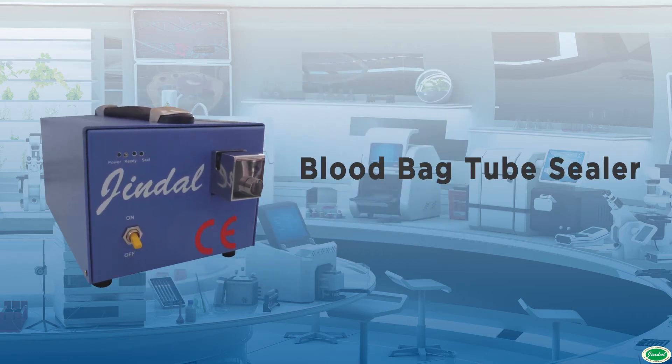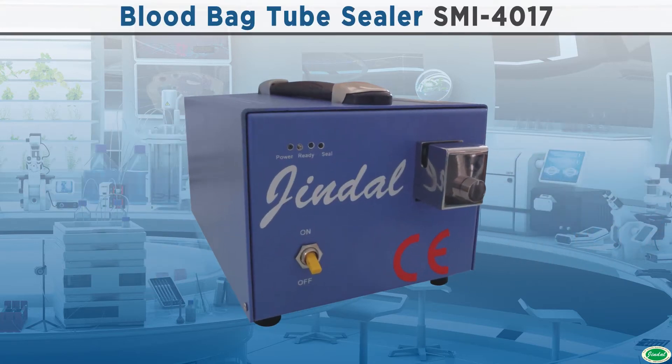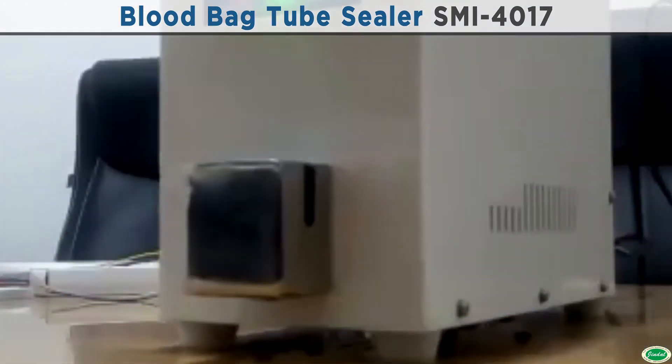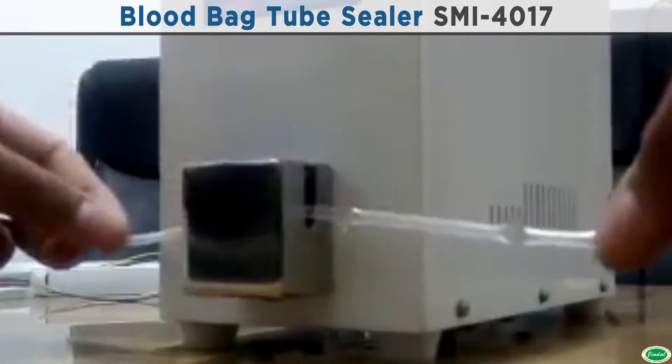Jindal Blood Bag Tube Sealer is a compact machine to seal the blood bag pilot tube by radio frequency sealing system. No hemolysis of blood in the pilot tube, because radio frequency sealing seals the tube without damaging the blood cells inside.